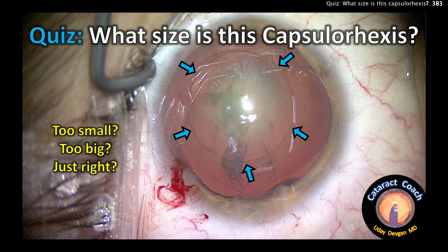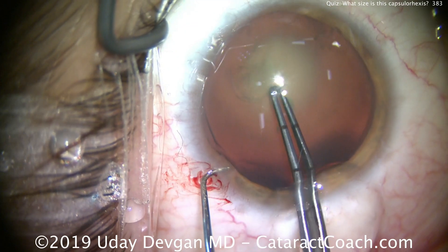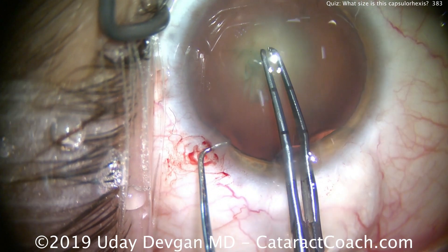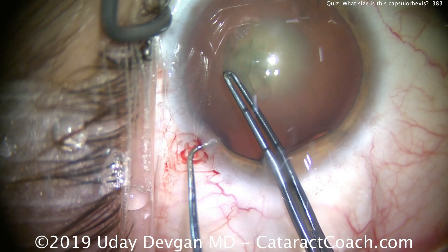Quiz time from cataractcoach.com: what is the size of this capsulorhexis — too small, too big, or just right? Let's watch the creation of this. We're using the chopper on the left hand to fixate the eye so it doesn't move.